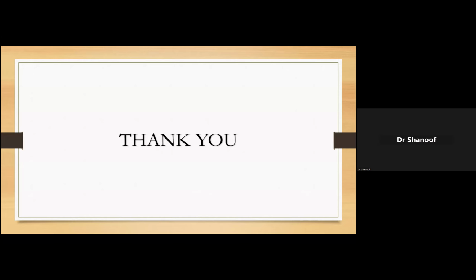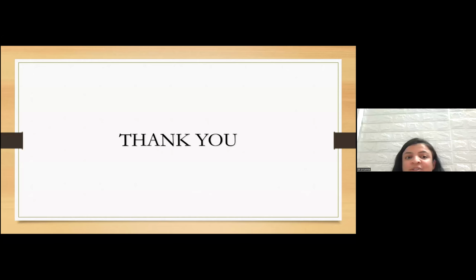What are your thoughts on the resin-based sealers? See, that also works very well. The reason I use bioceramic is I have seen promising results first of all, and it is fast results. But resin-based sealer also works very well if you disinfect your canal properly and if you seal your canal properly. In the end, what is important in proper non-surgical root canal treatment is that you need to disinfect your entire root canal system, whatever is causing infection over there, you need to disinfect it.